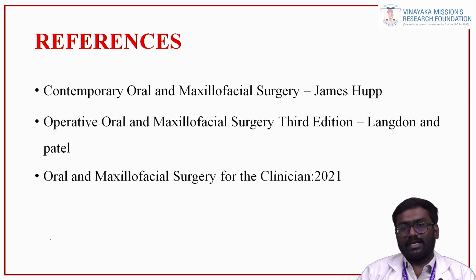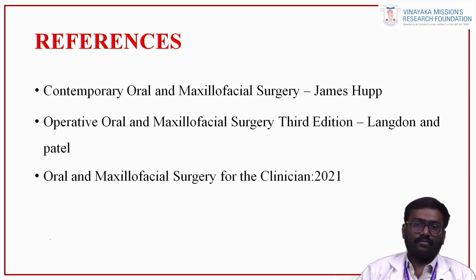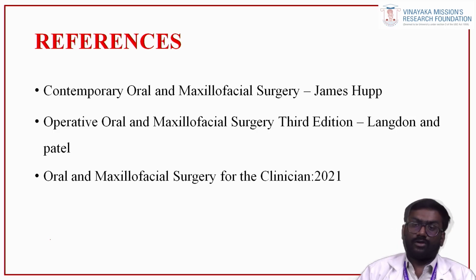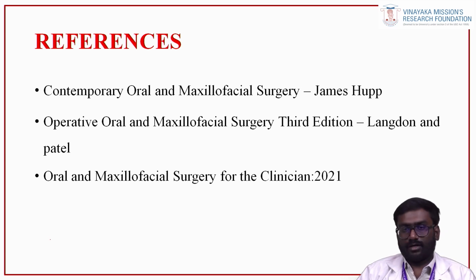The steps, the common incisions, advantages and disadvantages, and the common flaps that are used were discussed. The main ideology of incision and flap is proper access, visibility, and proper reapproximation, so as not to land up in a scar or gingival recession. Then the next step we discussed is locating the area of surgery. If there are perforations, the lesion would have already located it by creating fenestrations or an opening. If not, a bony window has to be created, which can be identified from the preoperative radiograph.